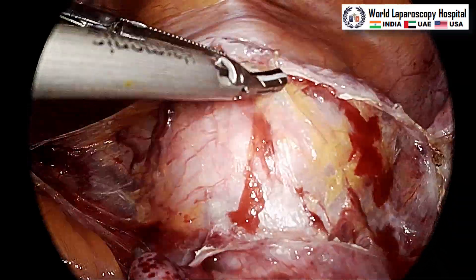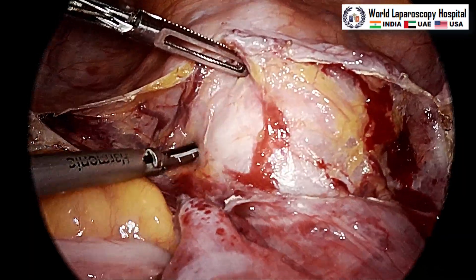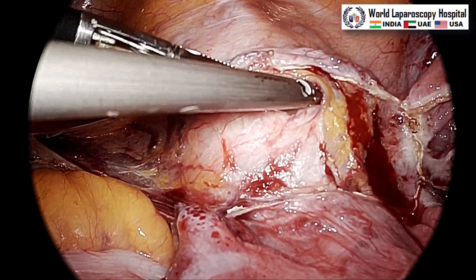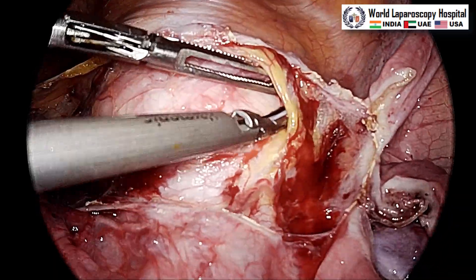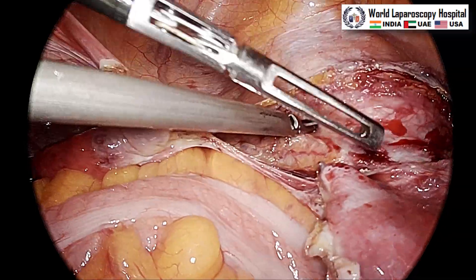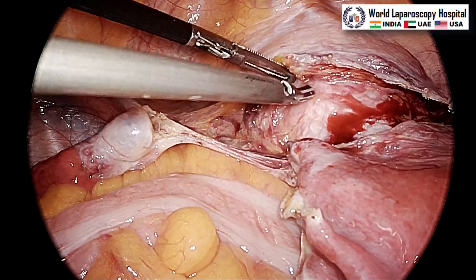The assistant is pushing the uterine manipulator retroverted and this is the bladder which we are pushing down. You can see the pearly white color with a criss-cross pattern of vessels, which is very characteristic of the vagina. The bladder is getting separated and the bladder pillar should also be lateralized. This is important in laparoscopic hysterectomy so that the bladder pillar muscles are lateralized, the ureter will also go lateral, and then the uterine artery can be easily coagulated as it gets skeletonized.